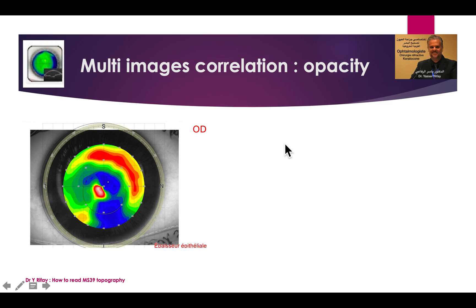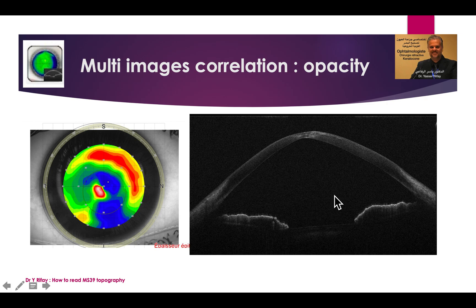When you have a keratoconus with a donut image but there is thickening inside, in this case you should examine the OCT and you will find opacities and irregularity of the stroma. So in every case of an epithelial mapping, you should look at the OCT scans to look for any haziness or irregularities or scars in the stroma.